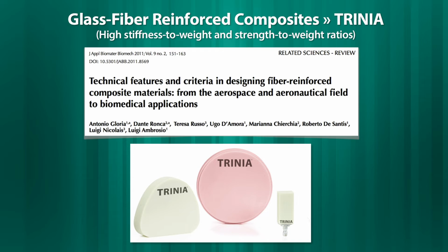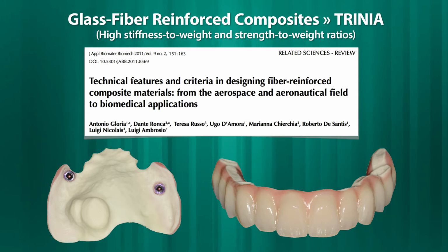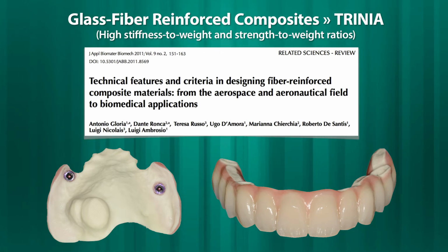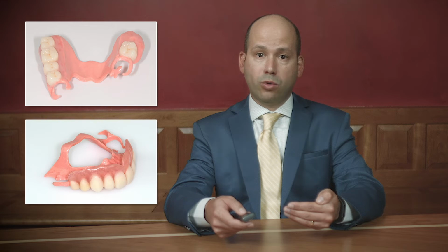Although fiber-reinforced composites can be handmade, our focus is on the use of reliable industrially provided blocks or discs for CAD/CAM milling, which creates opportunity for several prosthesis designs, including partial or full-arch fiber-reinforced frameworks to be either hand-layered with resin composites or acrylics, or to even receive milled all-ceramic materials that can be bonded to it. It also includes indications for removable partial denture frameworks and conventional dentures.